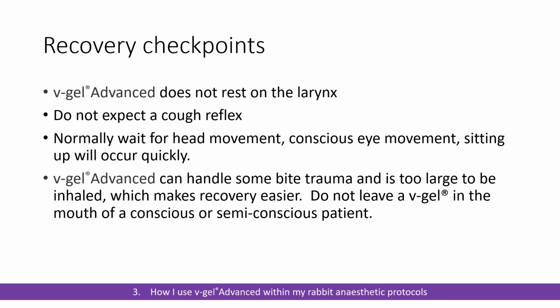The v-gel advanced is much tougher than the endotracheal tube, and of course it's too large to be inhaled. So it's less stressful in that recovery period. But to avoid panic, you do not want to be leaving a v-gel in the mouth of a conscious or semi-conscious patient, because they're not going to like it. So at the point that you start to see conscious response, remove the v-gel.